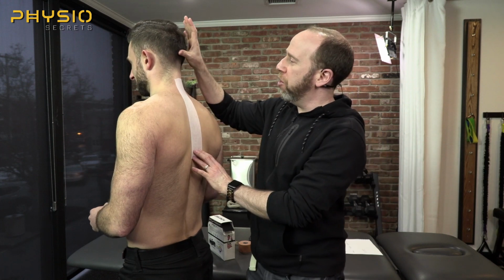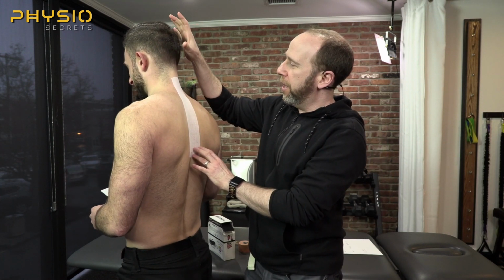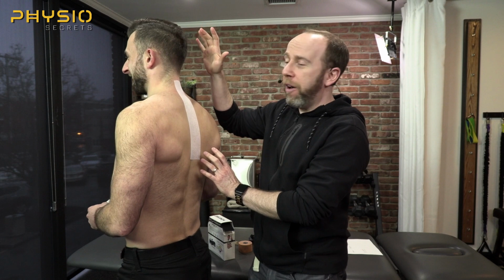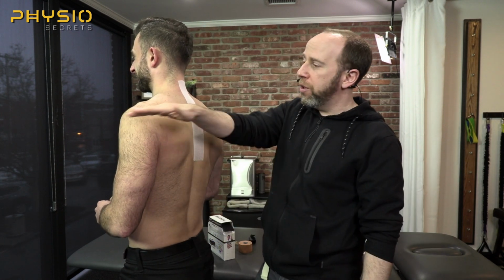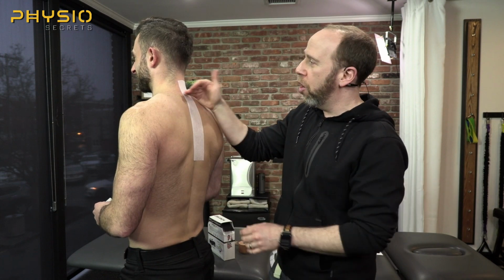And as long as your head is down, you feel the tape pulling, correct? Oh, yeah. And it's pretty strong. Oh, it's crazy. And it's not coming off, and you can shower with it. So I do this for the cervical, I do this for the lumbar, I do this for the periscap. This is gold right here.